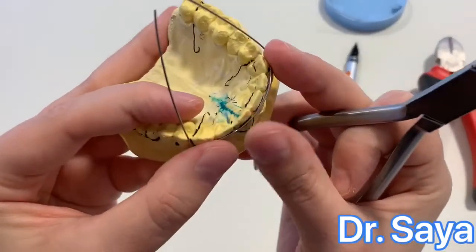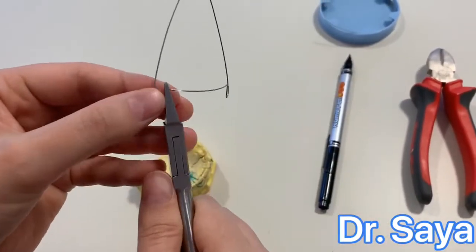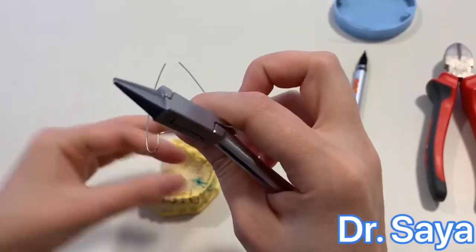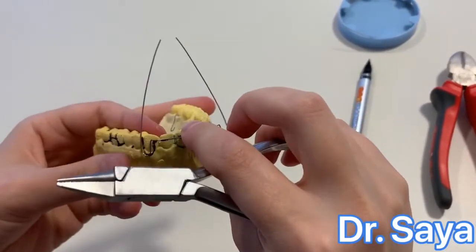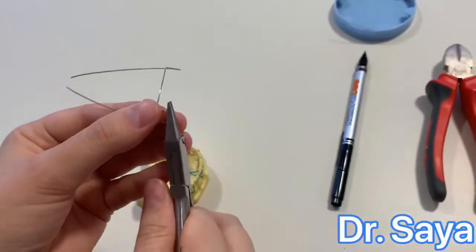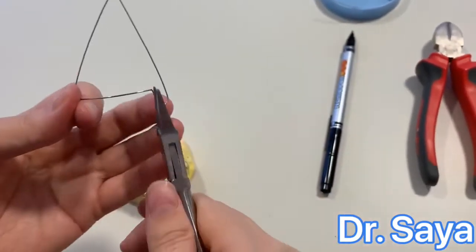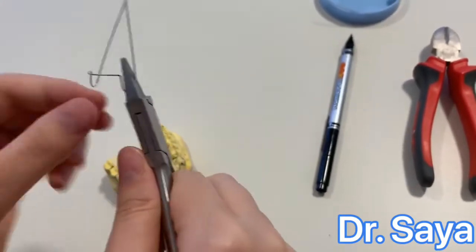Now that the incisal segment is adapted, we are going to adapt the loops. Hold with the plier and with your finger push it inward toward the cast, slowly, little by little. Now this side is adapted — it's good.